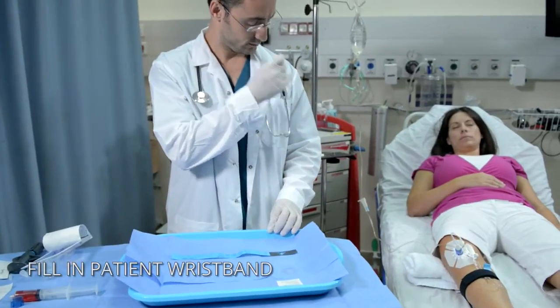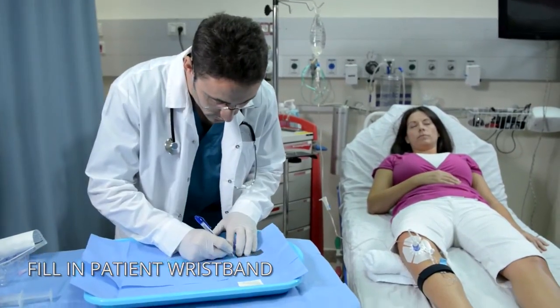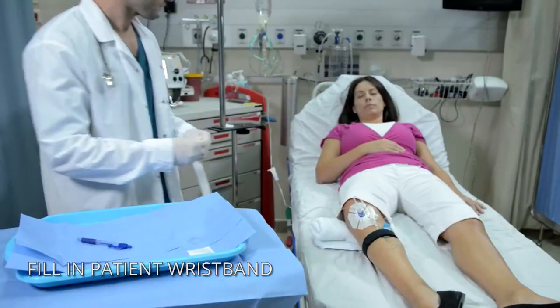End the procedure by filling out the details on the patient wristband and wrapping it around the patient's wrist.